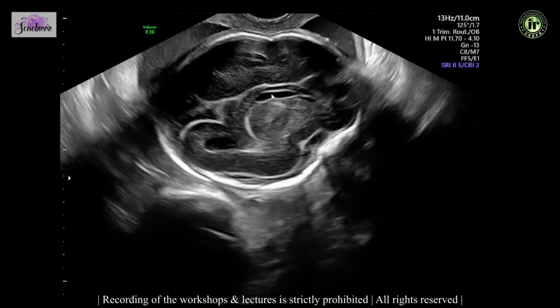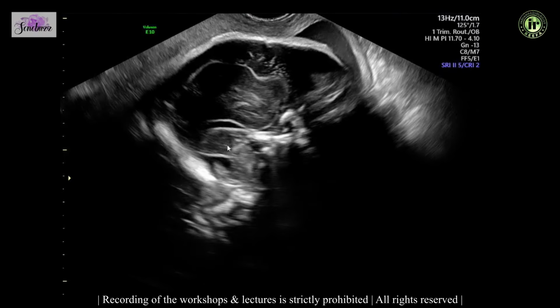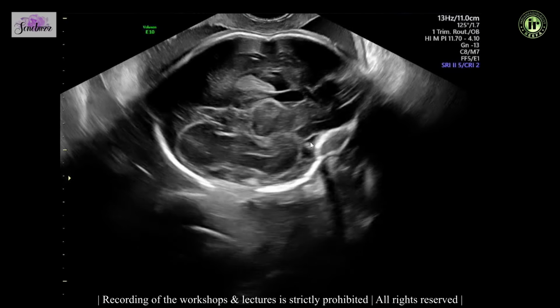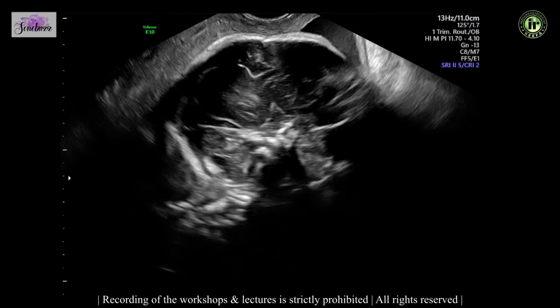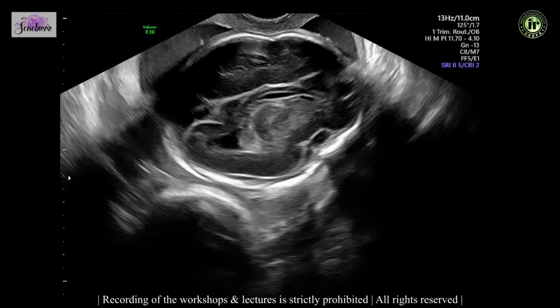This is the 3-horn view, the oblique view. You can see the frontal horn. In a couple of seconds you will see it again. The occipital horn and the temporal horn, and that's the sylvian fissure here. So it's a slightly oblique view, and I will try and freeze it at a particular point. Yeah, that's the 3-horn view. You can see the sylvian fissure, frontal horn, occipital horn, temporal horn.